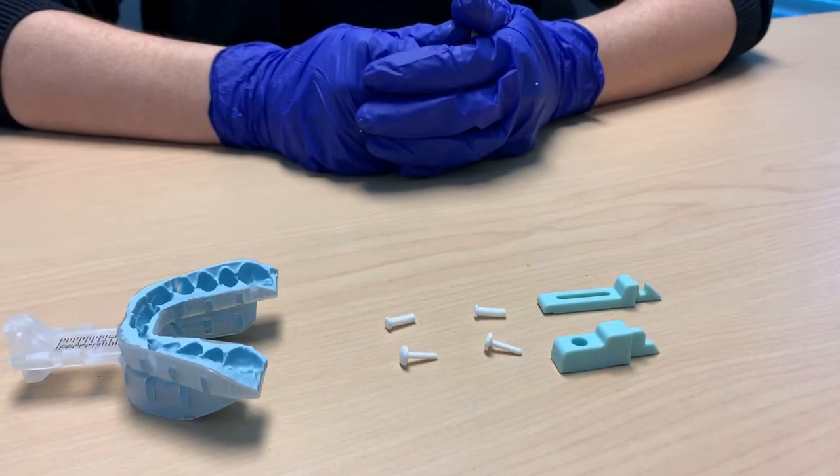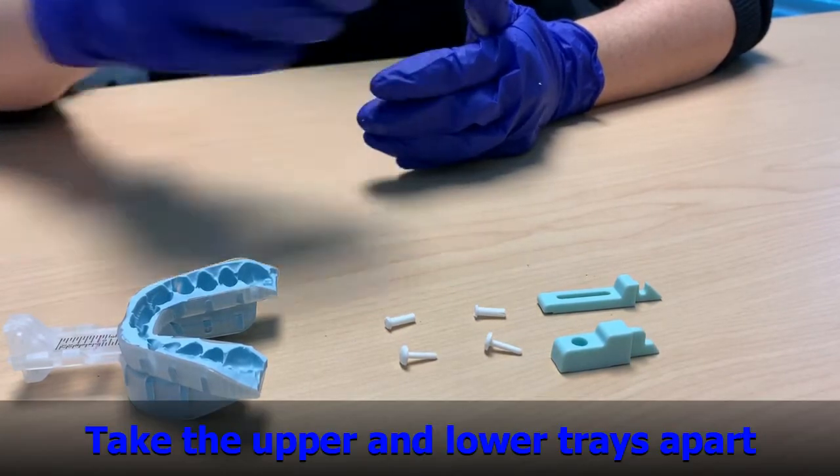Step 1. After removing trays off the MP, take the upper and lower trays apart.